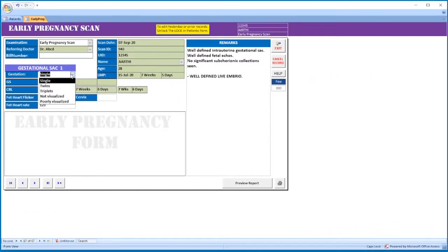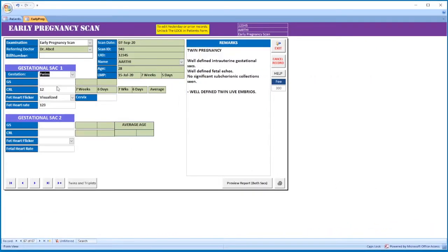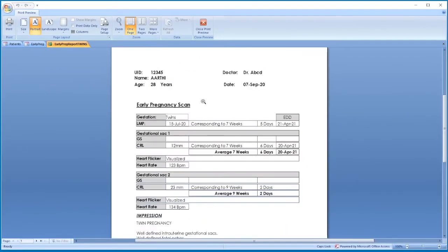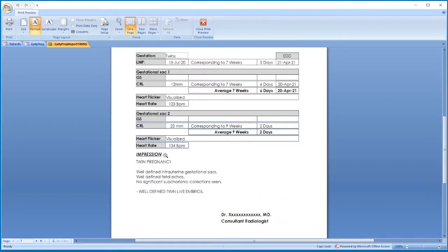If it is a twin pregnancy, select the gestation twins and use the additional box for twin sac. Enter the details here — the twin template is automatically pasted here. Print the report. This is the printout showing patient details, sac 1 details, sac 2 details, and the impression.